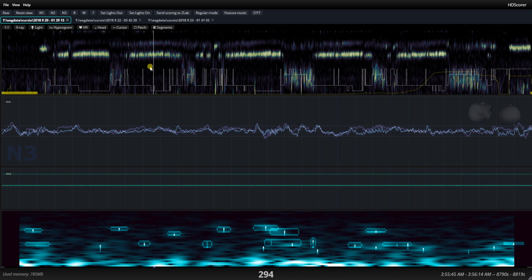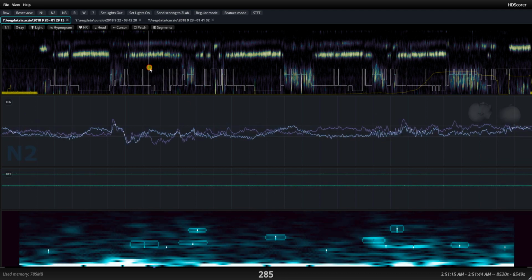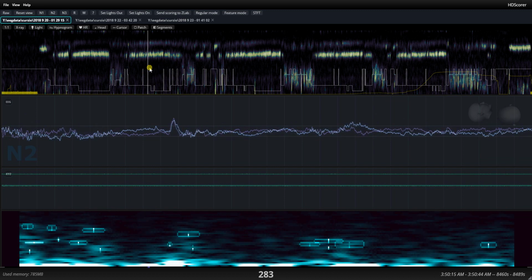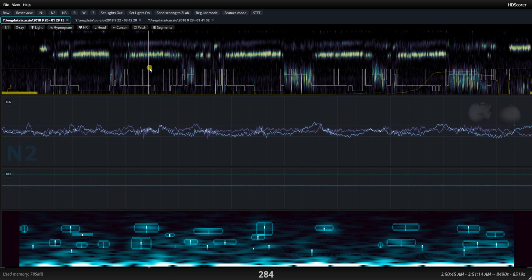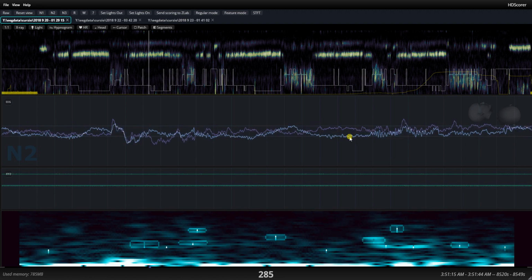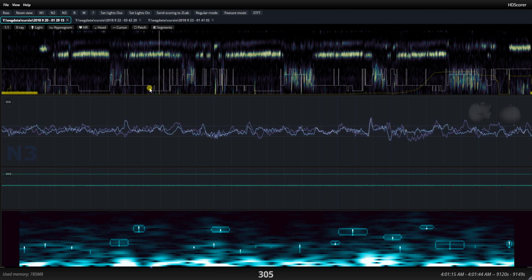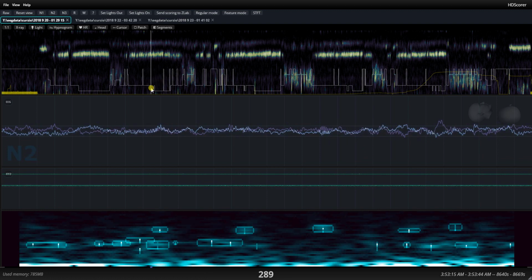Now, is this precise, accurate to AASM rules? No, I'm not using that AASM threshold because it's going to be inaccurate most of the time. So as long as there's a little bit of sweating, there might be a little bit of sweating right here, which brings this thing over the edge. I don't want to rely on that. It's too non-deterministic.